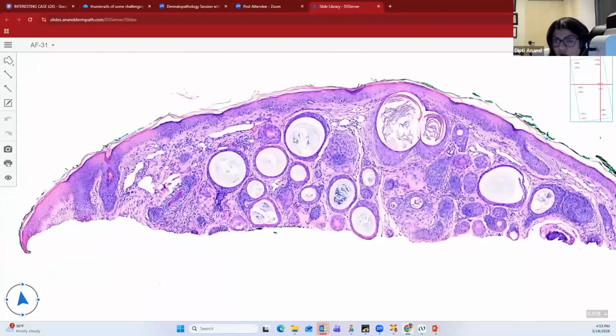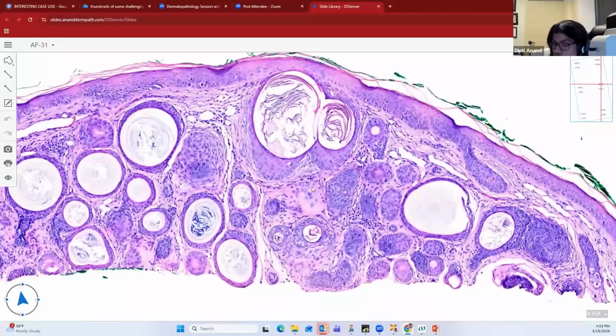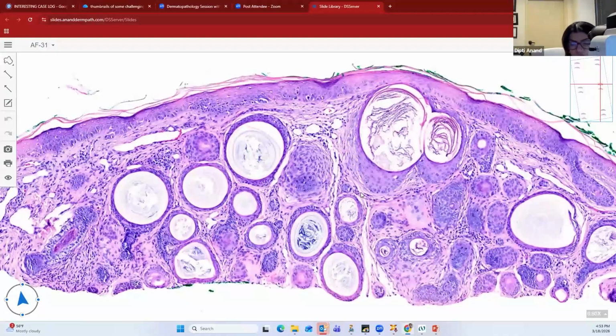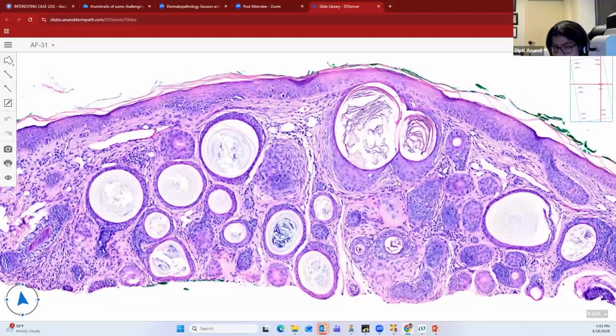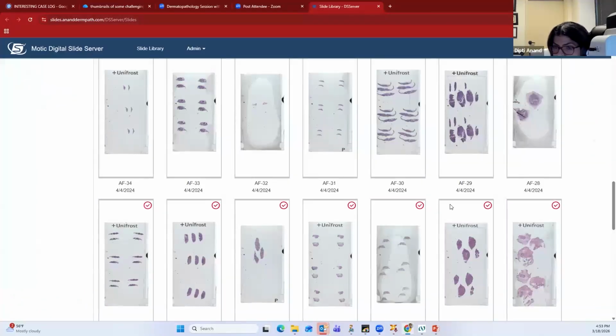If a lesion has predominantly the cystic structure, so it predominantly has horn cysts with very little of the immature hair follicles, it's a trichoadenoma. It's the least common among the trichoadenoma, trichoepithelioma, and trichoblastoma. So you can see the nice uniformly placed horn cysts with these immature hyperchromatic basaloid islands. So that is your trichoadenoma. The most common among all of these is going to be a trichoepithelioma.